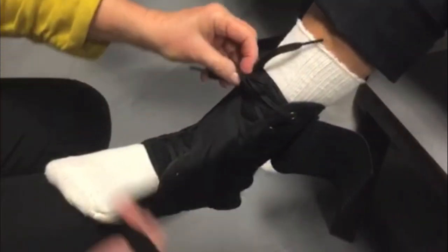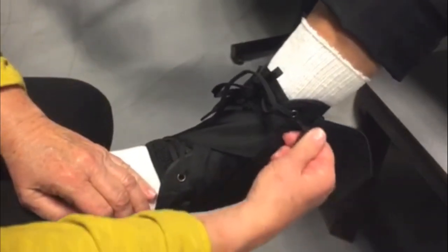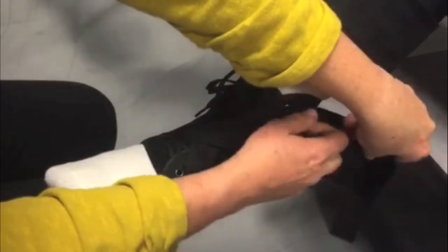Bring the outside or lateral stabilizer strap across the top of the foot and under the heel. Attach the loop end of the strap to the hook side of the brace on the lateral side.